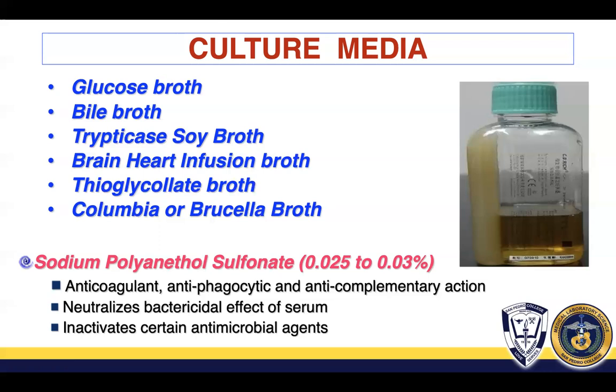It can neutralize the bactericidal effect of serum, and it can inactivate certain antimicrobial agents. Examples of antimicrobial agents that can be inactivated by SPS include gentamicin, kanamycin, streptomycin, and polymyxin B.